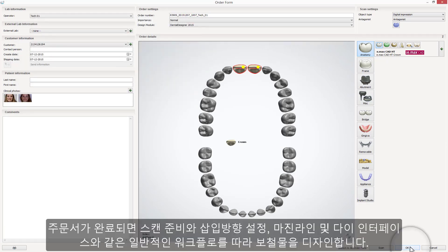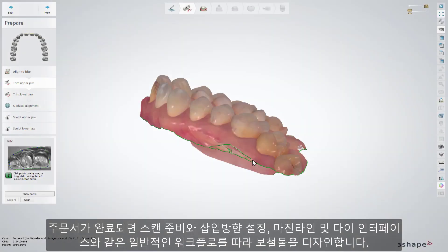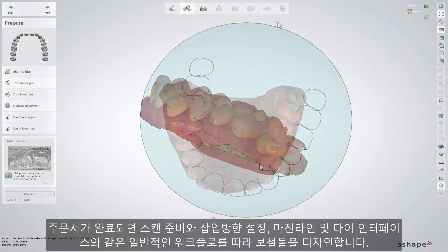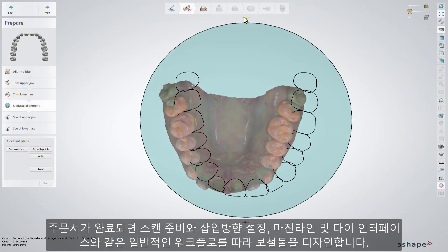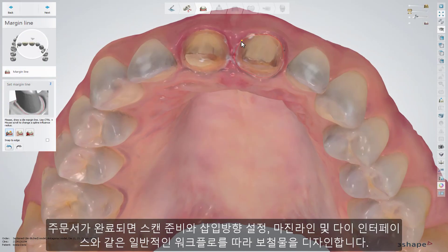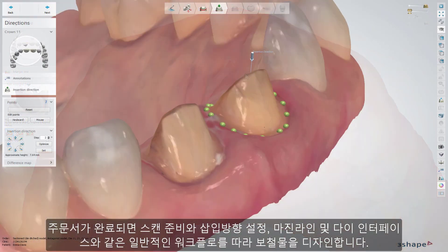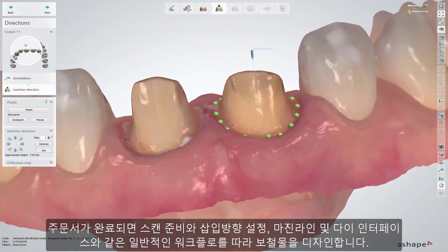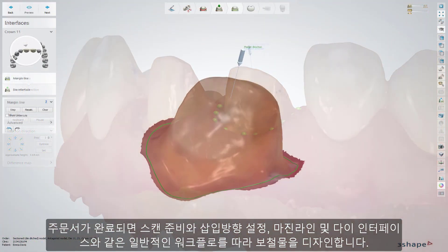Once the order has been created, follow the usual workflow path of preparing a scan, setting the insertion direction, the margin line, and die interfaces.